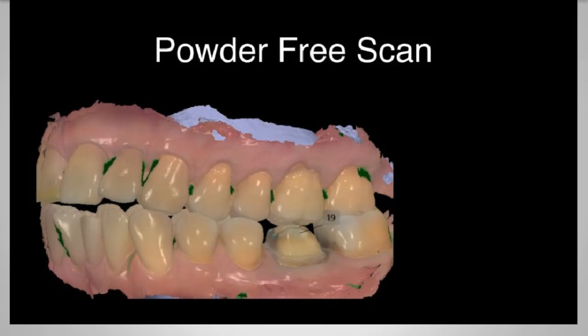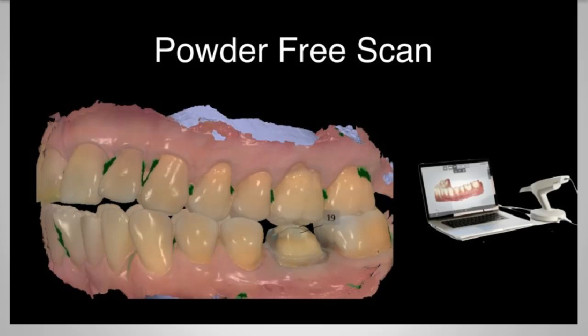So in this case, we have a digital impression that was taken. Now, digital impressions can be very predictable today. However, with digital impressioning, soft tissue retraction is still a must, and in some ways even more important. By no means, if someone goes digital, are they free of soft tissue management. In many ways, it's actually more difficult in terms of soft tissue management.